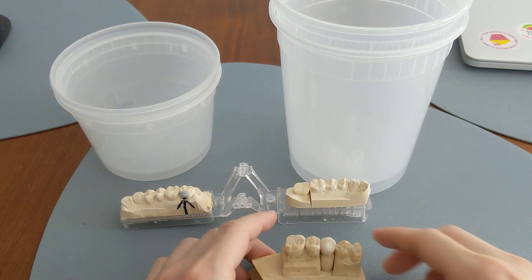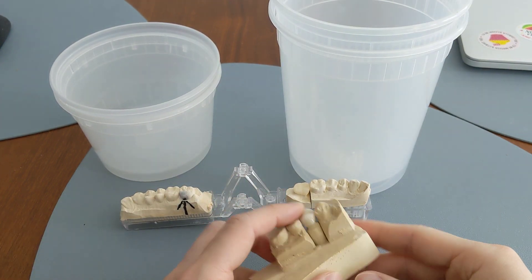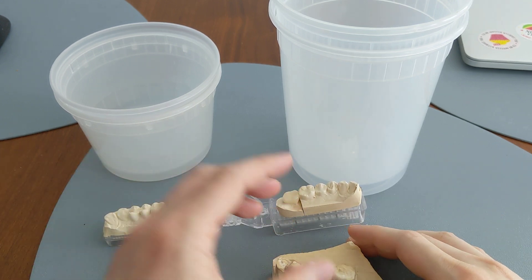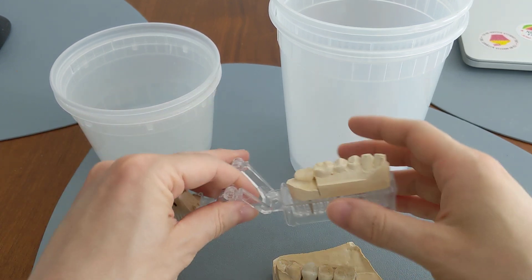Essentially what this means is that if you have a zirconia crown that keeps coming off, the reason could be because you have a very short clinical crown, so the crown can't hold on as well.